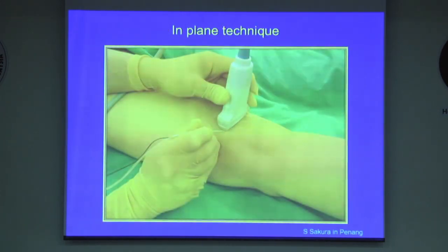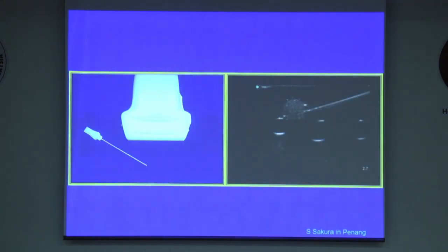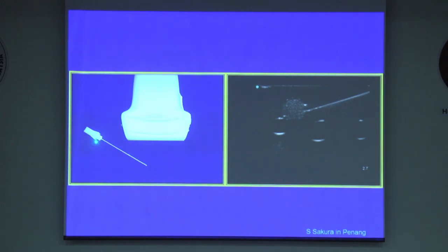There are two needle insertion techniques in relation to the transducer: in-plane technique and out-of-plane technique. With the in-plane technique, the needle is placed in the plane of the ultrasound beam. As a result, the needle shaft and the tip can be observed in a longitudinal view in real-time as the needle is advanced toward the target.